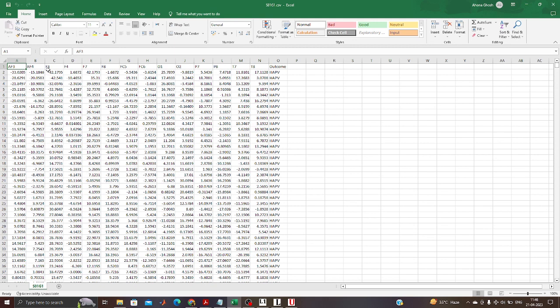This particular thing means subject 1 has played game 1. Actually, the dataset contains the data from 14 subjects and 4 games. So for subject 1 and game 1, this type of data was there, where the column heads are the EEG electrodes only. So AF3, AF4, F3, F4, F7, F8, FC5, FC6, O1, O2, P7, P8, T7 and T8 are the EEG electrode names from where the data has been recorded.